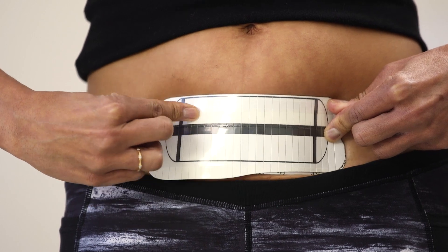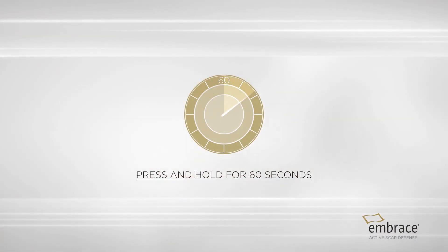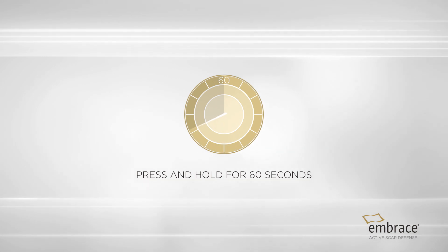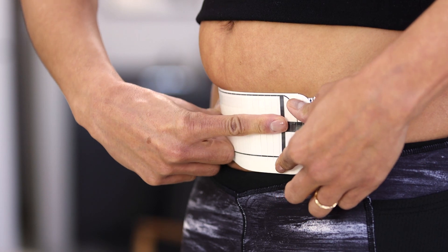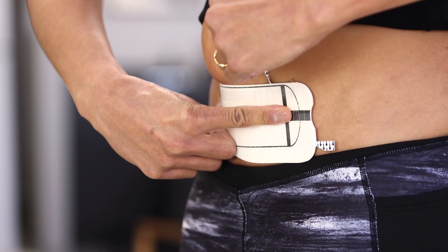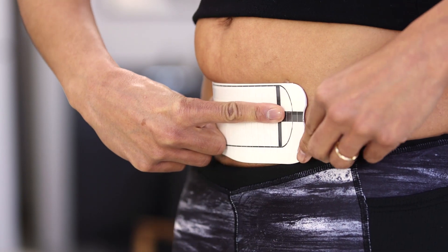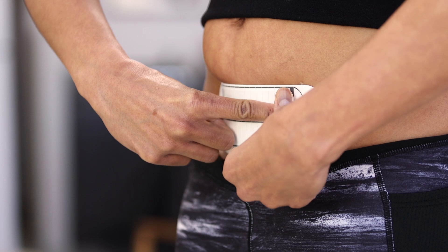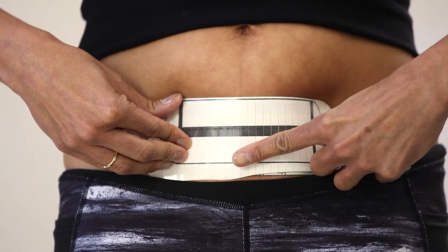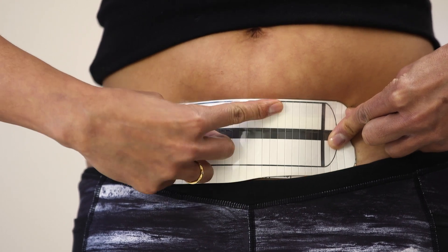Press and hold the dressing on the skin and rub each of the vertical bands on the applicator. Pressing firmly activates the pressure-sensitive adhesive. Continue to hold the applicator firmly in place with your fingers alongside the dark stripe. With the other hand, pull one tab to the side and along the edge of the applicator. While maintaining pressure, repeat this step for the second tab to release the dressing from the applicator. Before removing the applicator, rub each of the vertical bands on the applicator one more time.